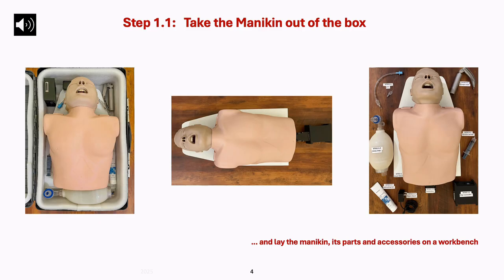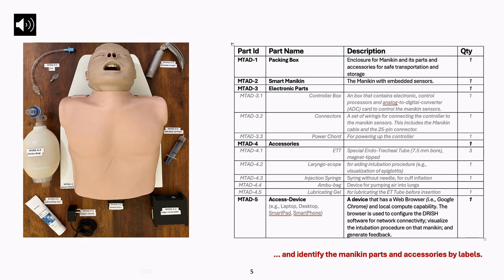Part 1, Step 1.1. Take the mannequin out of the box and lay the mannequin, its parts and accessories on a workbench. We can identify the mannequin parts and the accessories by the labels on them.